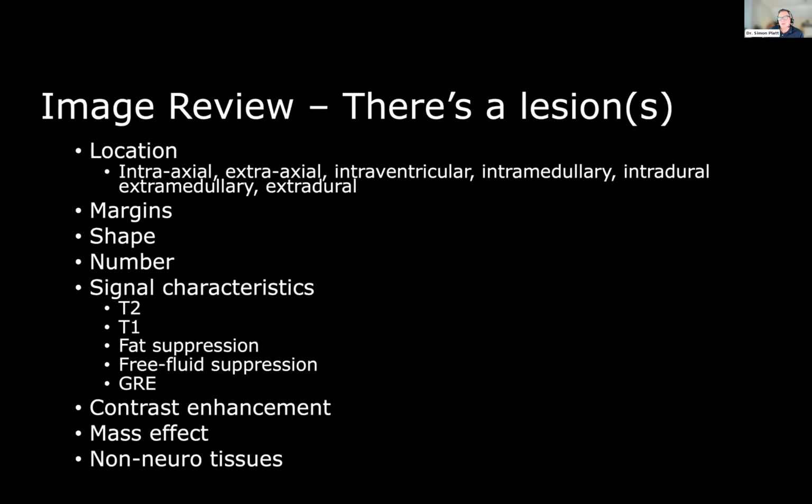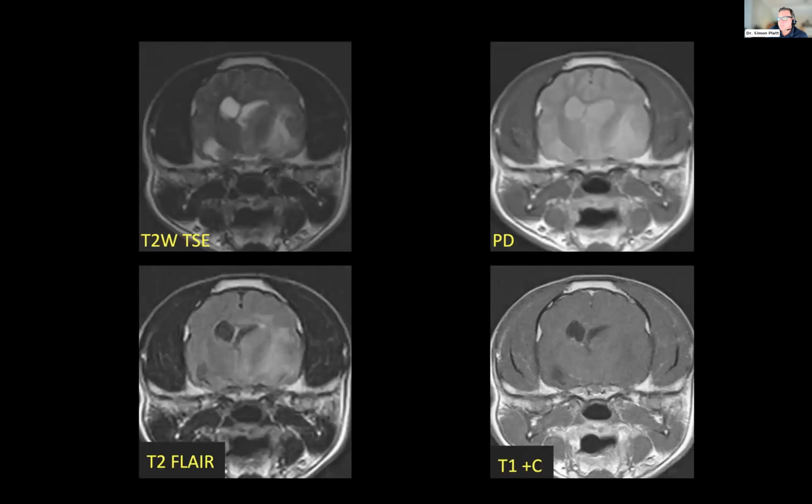Yeah, excellent. And unfortunately, I still have to teach myself to keep looking, even when you've found some glorious lesion that explains everything. Yeah. You'd mentioned quite a bit about proton density images, and obviously we don't use them a lot anymore. Have you got any tips for what they may be most suited for, or when you would use them, or do you just incorporate them all the time?